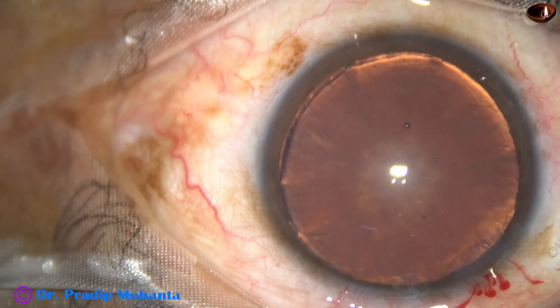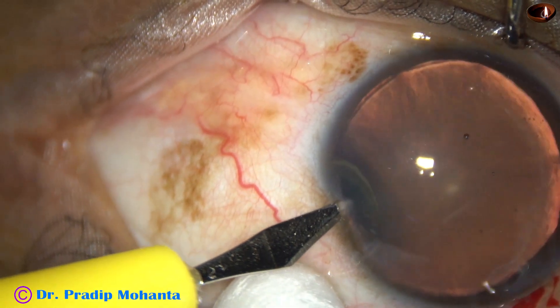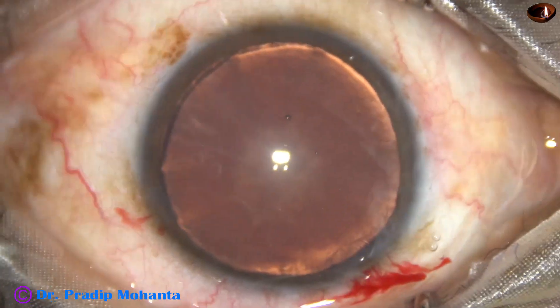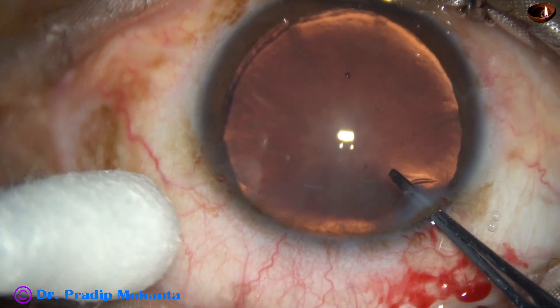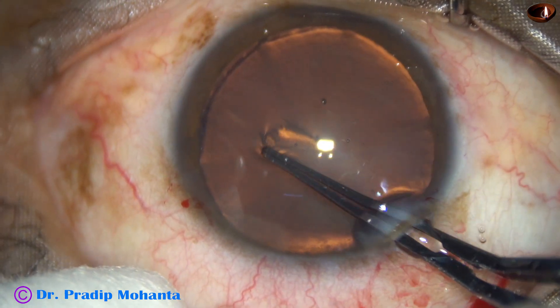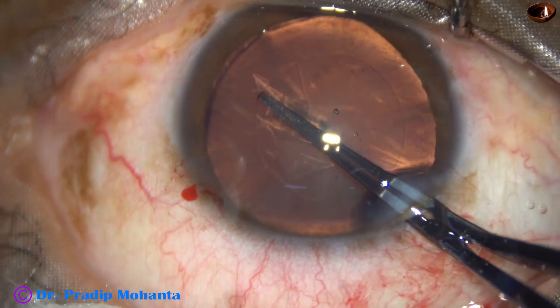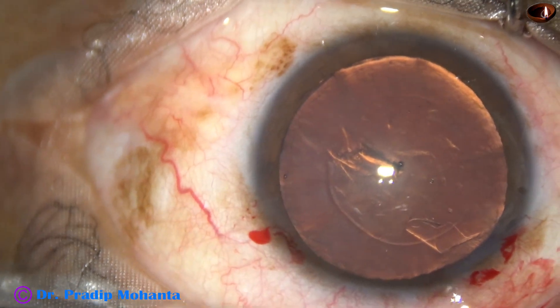A side port is made on the left side of the main incision, about 3 o'clock hours away. Now capsulorhexis is to be done. I use utreta forceps for doing capsulorhexis. The central part of the capsule is punctured. We go towards 4 o'clock, hold on the side of the cleft and go anticlockwise and do the rhexis. The size of this rhexis is about 5.25 millimeter.